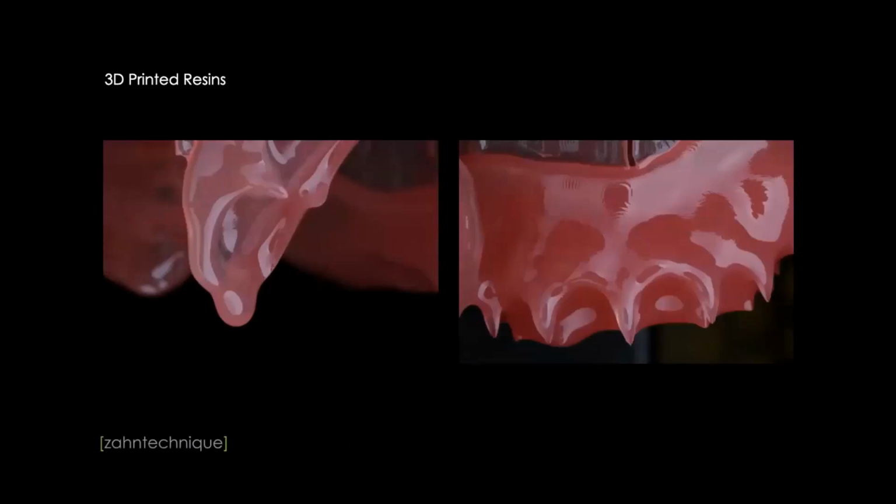So on the resin side, I think that's very important to understand. I would even say they are the most advancements done over the last few years in resins, because we used to have resins that were not very predictable. They were not very consistent in terms of curing, in terms of volume. There was a lot of shrinkage. But over the last years, there were a lot of advancements. The resins really got very good, right?